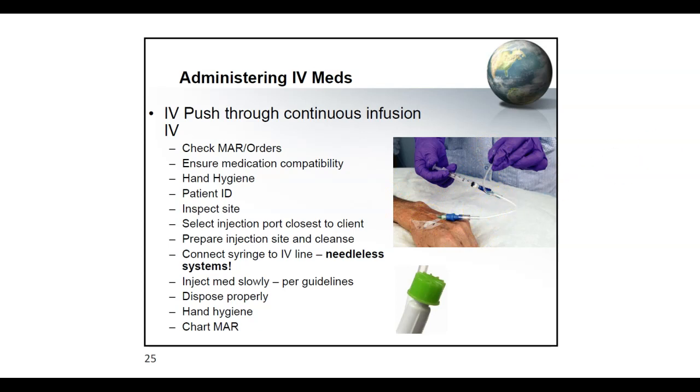Well, anyway, after doing that, prepare the injection site and clean it, and then connect the syringe to the IV line. This is a needle-less system. Back in the day, I feel so old, we used to have ports that we had to poke with needles to access that port, that IV. But now we have this needle-less system, which I think is really good. It's safer. Anyway, once you inject it, make sure you follow whatever is the recommended infusion rate, or how fast you're going to push the drug.